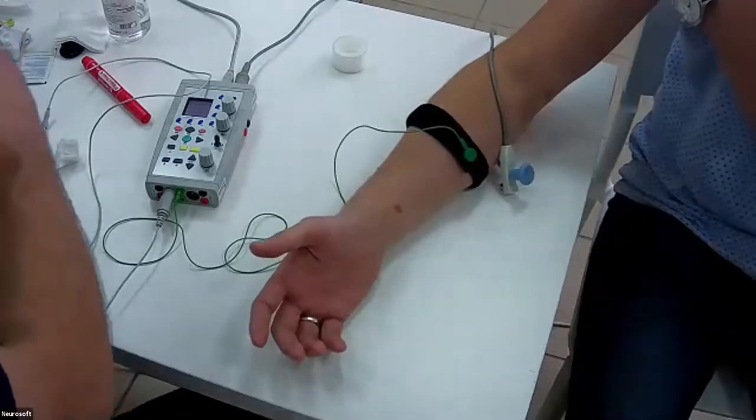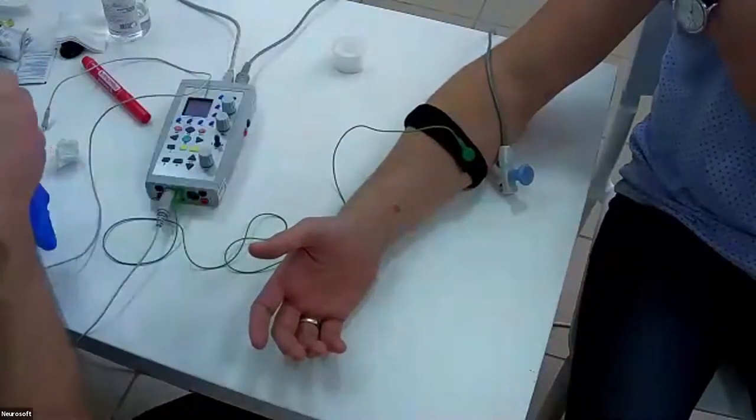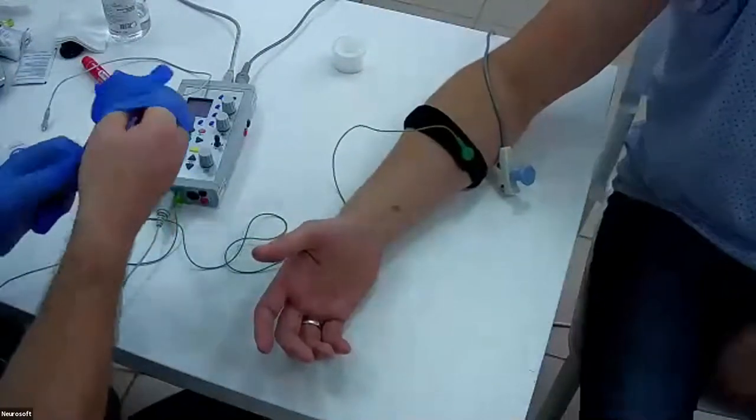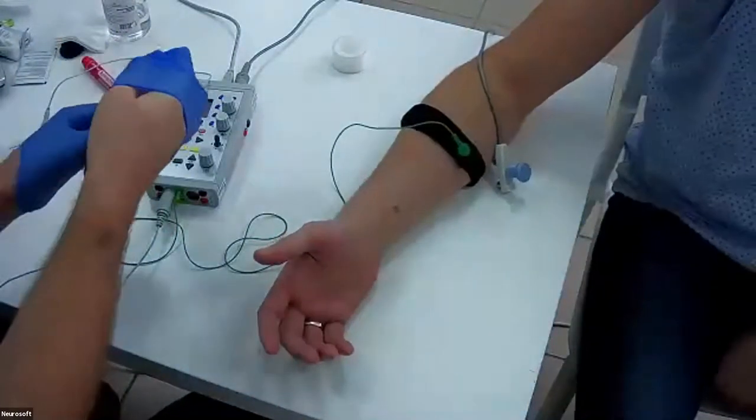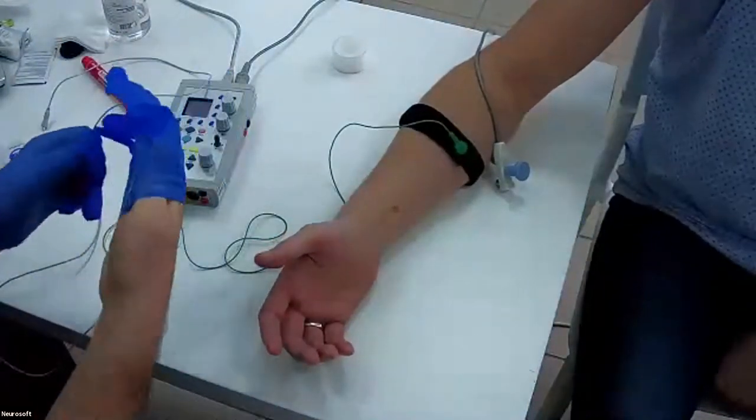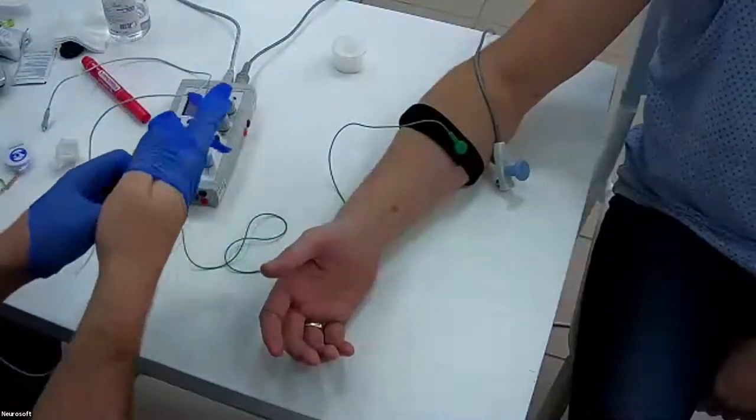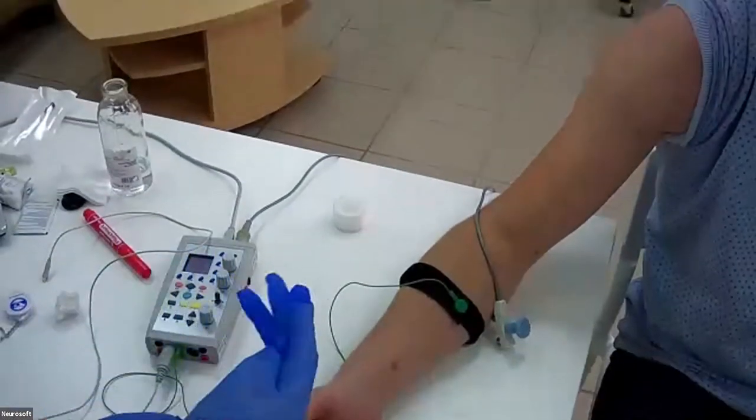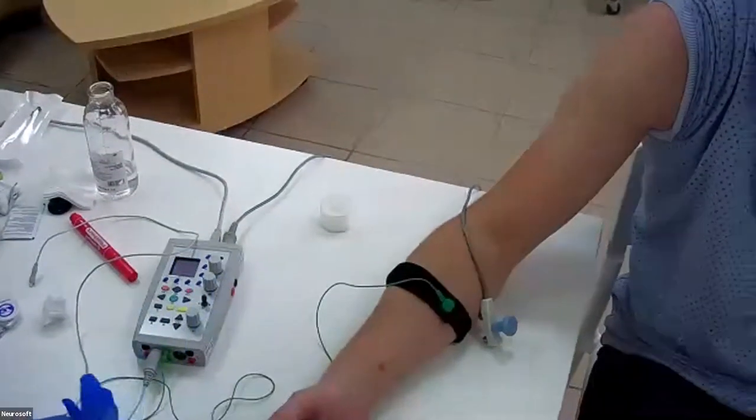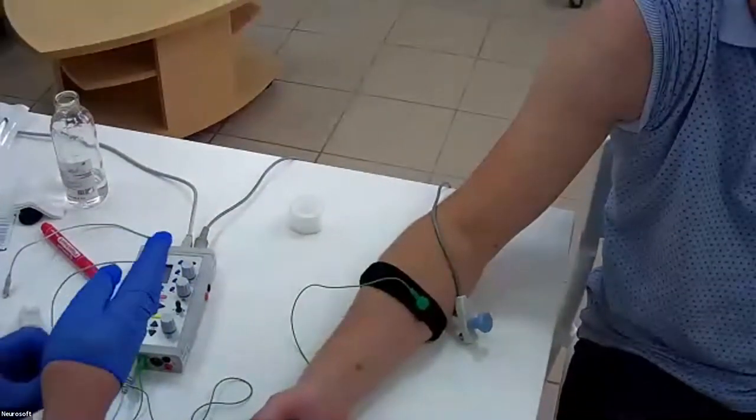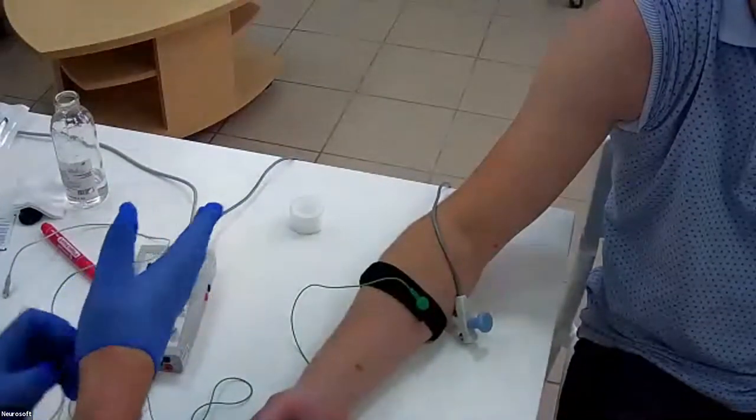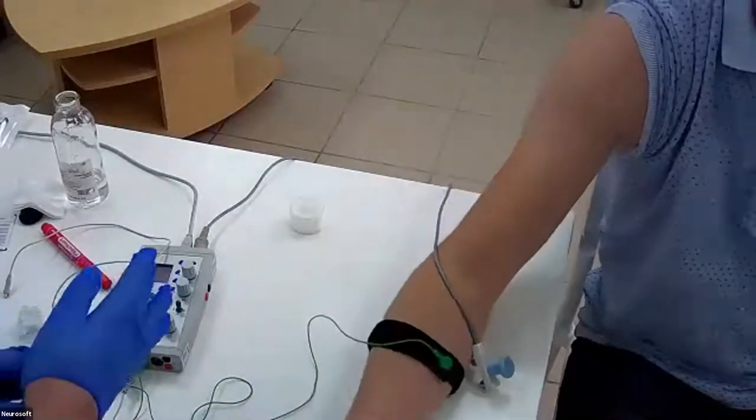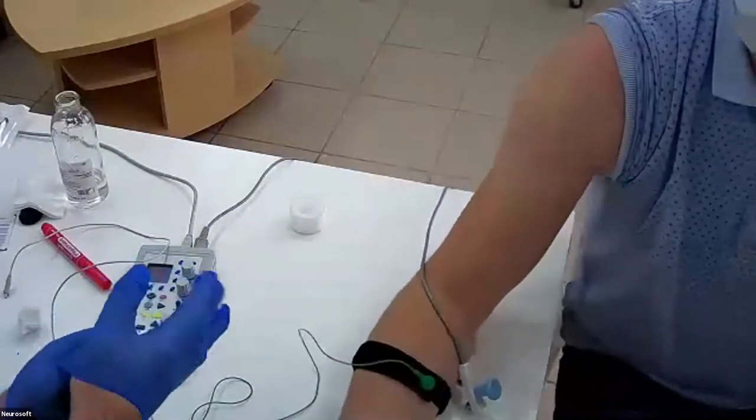We need to change the position of the camera. We will use the deltoid muscle for needle EMG examination today.